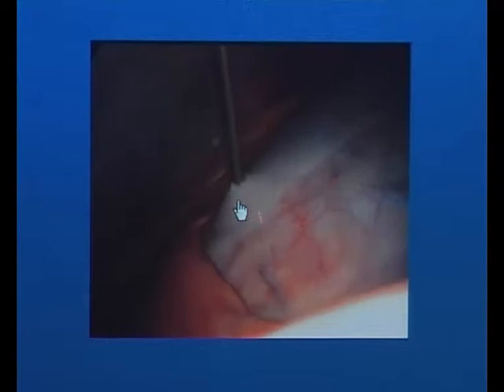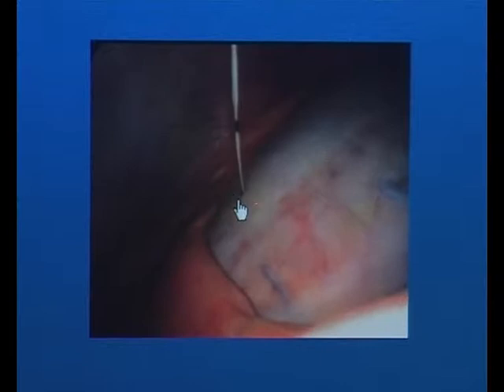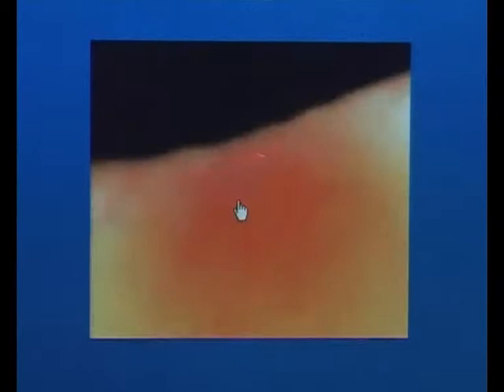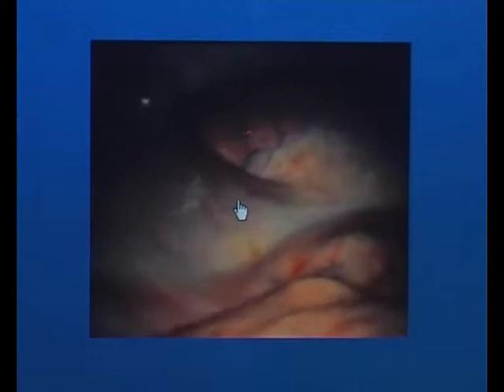If you remove it, you have a lot of fluid in it, and you see a little bit of abomasal fluid here. You have to pull it two or three times, and then the mucosa will close here next to the thread end, and we have no more fluid escaping into the abdomen. Now here you can see the correct position. Always check the correct position, so the abomasum, omasum and liver.